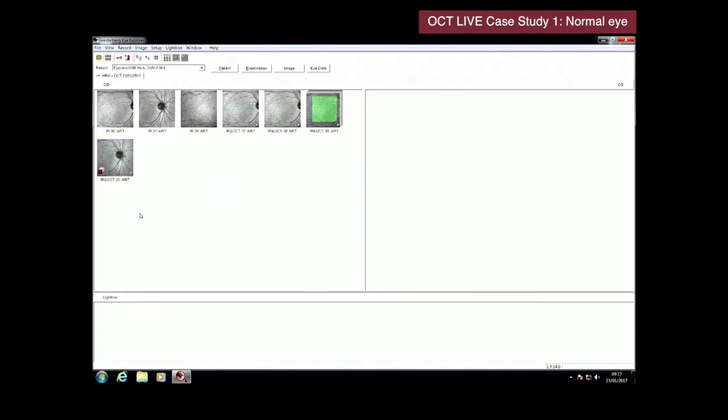The reason there is that the scans look normal in a glaucoma subject. Okay, there's nothing you can look at to tell you that this is abnormal, unlike macular disease. So you're relying on the device's ability to perform physiological measurement and to identify retinal atrophy and thinning of retinal tissues to tell you whether or not we're seeing progression. So we have to go back to the same location.